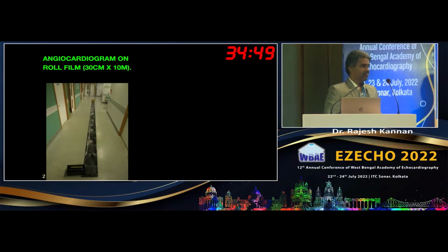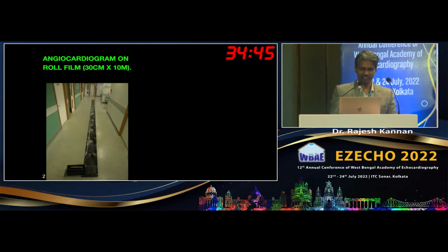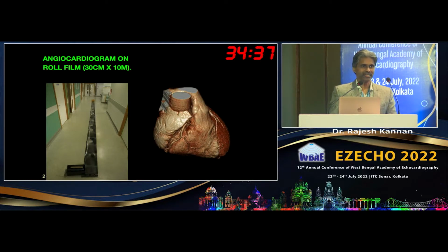We have come a long way in terms of coronary angiography, from a few decades back when angiography was done using roller film, to CT coronary angiography, where even without entering the aorta, you are able to get such beautiful coronary arteries.